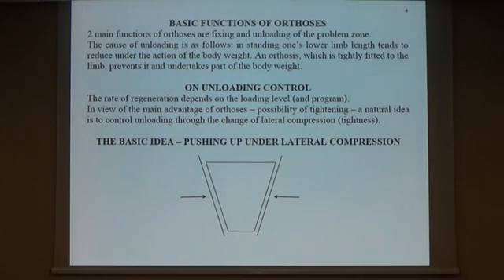Full loading of a limb before consolidation can lead to complications and damage to the problem area, while underloading results in marked weakening and atrophy of the musculoskeletal system and recovery time elongation. Therefore, obviously, there is some optimal level, more precisely a program of unloading, which on the one hand reduces the danger of repeated injuries, and on the other hand makes it possible to carry out dynamic correction of the damaged segment in a functionally correct position.